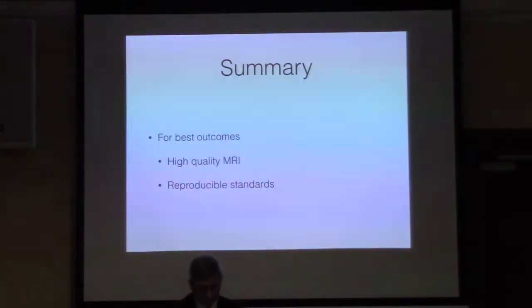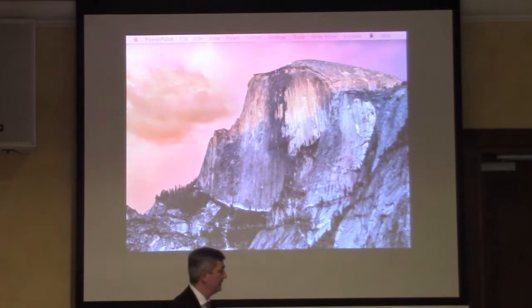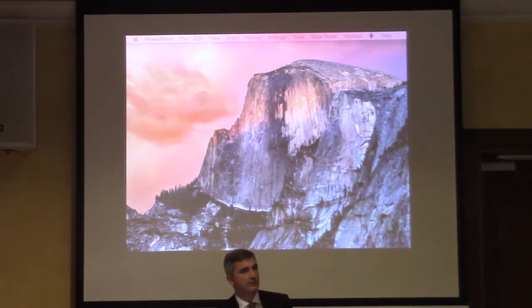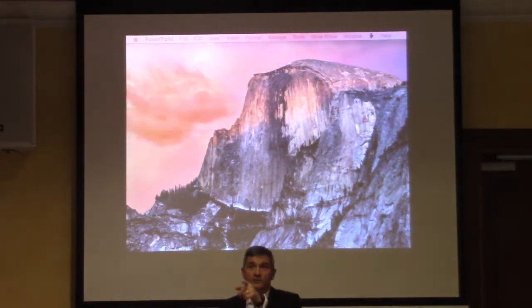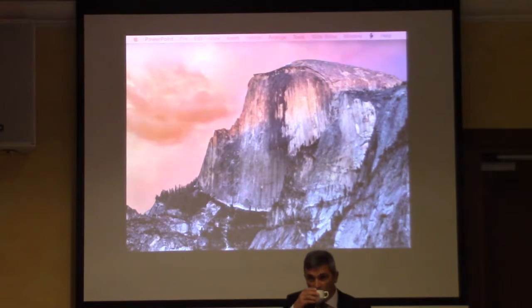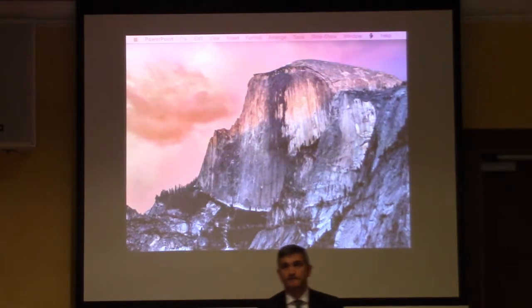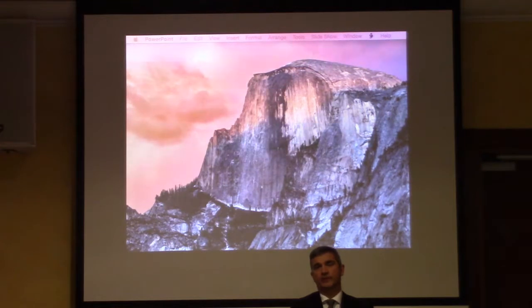Okay. So, has anyone got any questions to start off with about the practical aspects of doing rectal MRI that they wanted to ask? You look like you've got a question. Yeah, I have one. The thing you mentioned about the contrast administration is that there's no role for it? No. So you don't do it? We don't. Doesn't add anything. Even after chemotherapy?